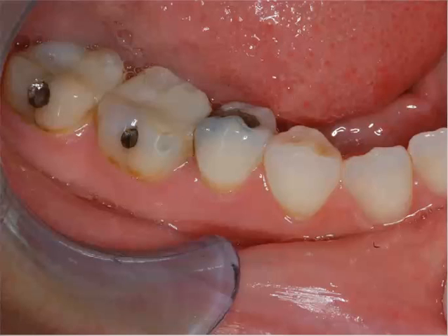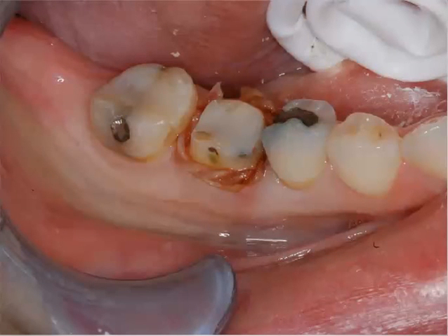Unless there's indication there's issues, don't get involved with removal and perhaps creating issues with pulpal reaction to placing some type of different base or any type of adhesive in there. Leave well enough alone. Just deal with it as an intact basis. You can see once we remove the interproximal contact, we have some hemorrhaging. Usually we hit the interdental papilla.